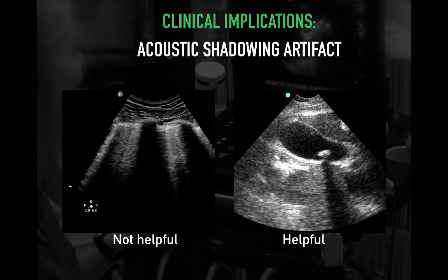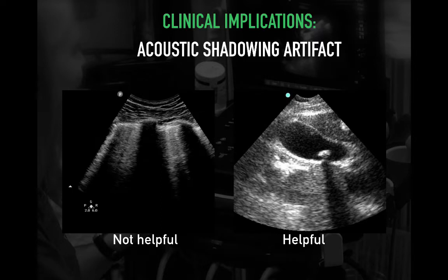Acoustic shadowing is largely unhelpful below ribs, but it does help you identify the bat sign, describing the rib-pleural-rib interface. On screen right, we can see a gallstone in the gallbladder and acoustic shadowing beneath — those sneaky buggers are pretty high attenuators. Also, central line catheters can be recognized readily with sonification.